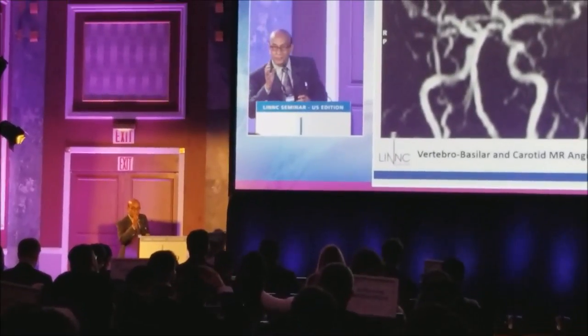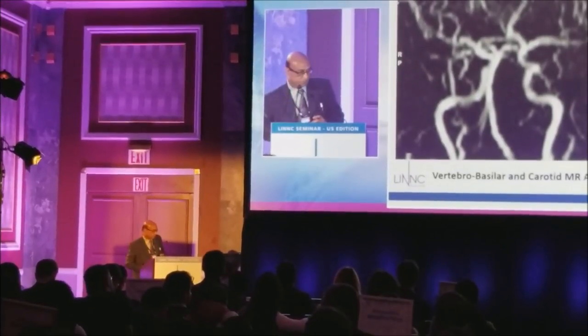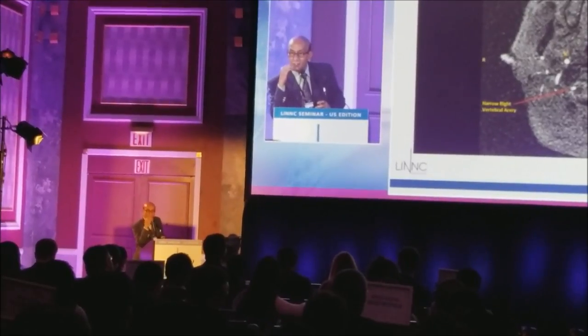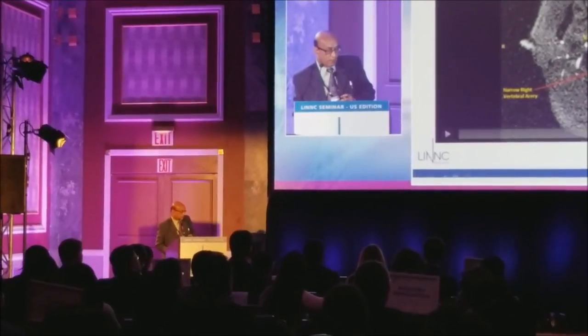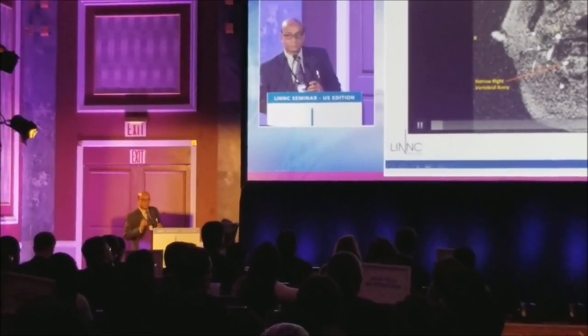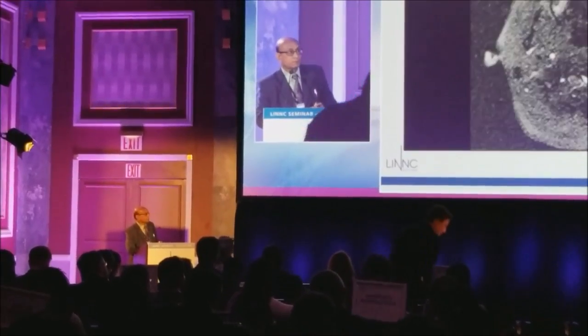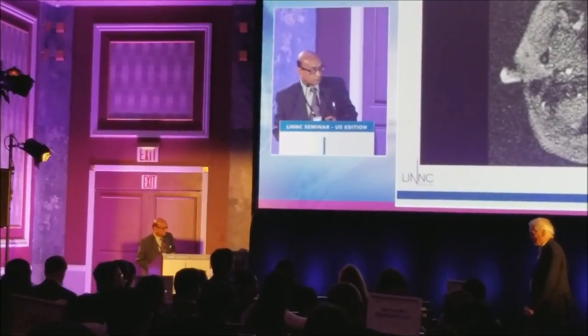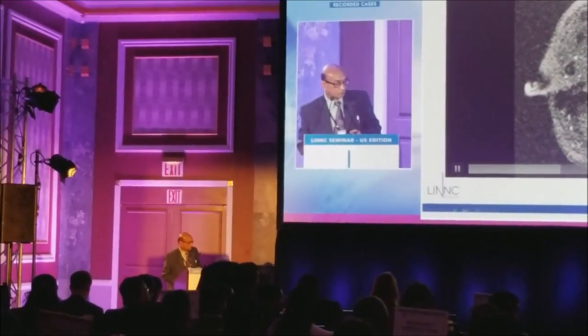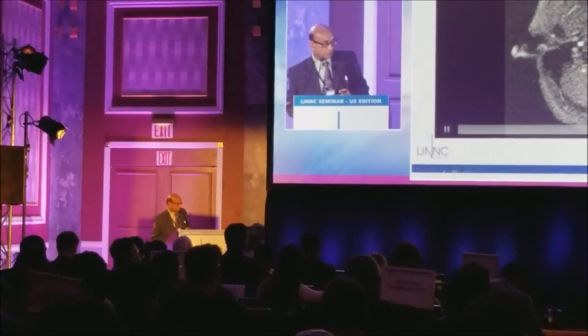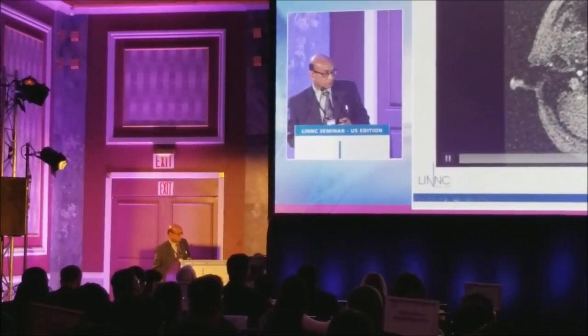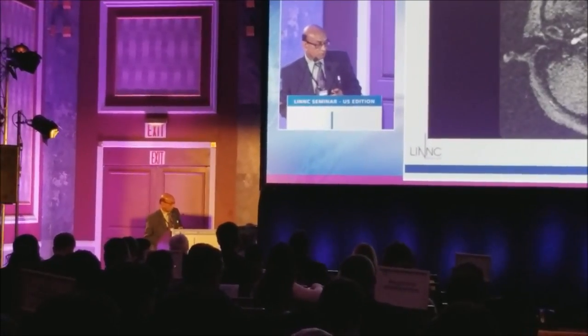You have to imagine, when you saw the video, that the patient's head is slowly spinning in a clockwise direction. So these are some screenshots. Now this is the same thing shown in 2-dimensional time of flight spoiled gradient recall echo acquisition MRA. Please take a close look — remember this is the right side, this is the left side. So this is the right vertebral artery. As the slices move up, we notice that there is an accessory vertebral artery on the right side, which is separate from the narrow right vertebral artery. As the slices move even further up, the narrow right vertebral artery has now become a bifid right vertebral artery. And as the slices move even further up, we will notice that the bifid portion is united with the accessory vertebral artery, while the main right vertebral artery remains narrow. And here we see the beginning of the droplet circulation.